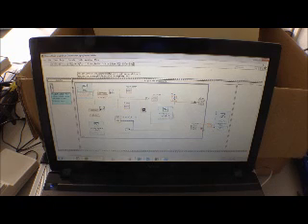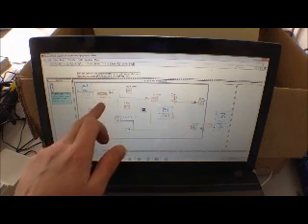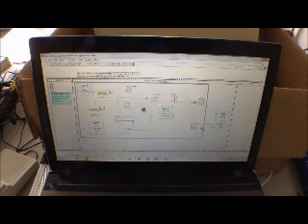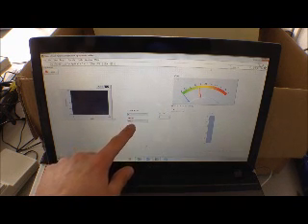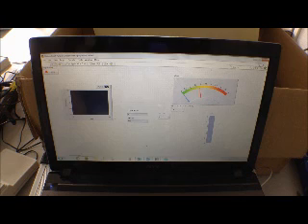This is the programming side of the MyRIO. Everything you can see here is all the inputs and outputs of the device. So we have the RTDs incoming up here in the top corner. So this is where your temperature is going to come in. Constants are derived from the manufacturer, and an RTD converter displays the value on a display which can be seen on the front panel, which is here. So there's the hypothenar and the thenar region. They're your temperatures, and they'll change when the device is turned on.